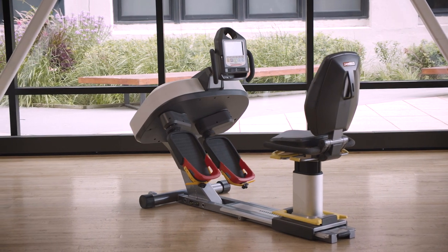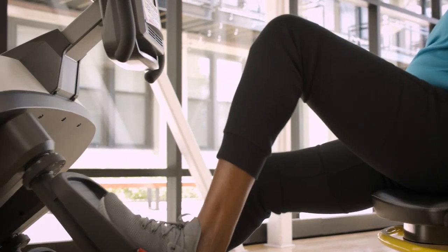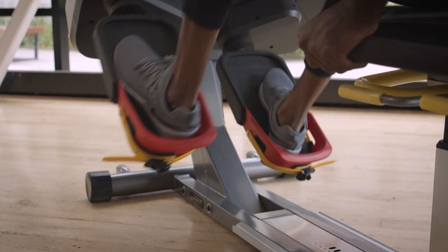The Latitude Lateral Stability Trainer is a necessary component of fall risk reduction because it triggers muscles not targeted with other common exercise equipment. Daily activities include movements in the forward, backward, and side-to-side directions.